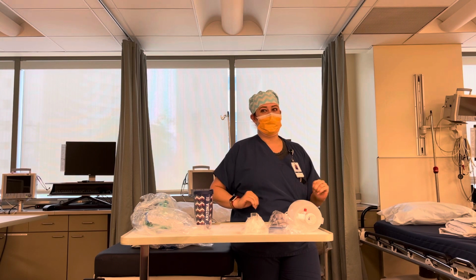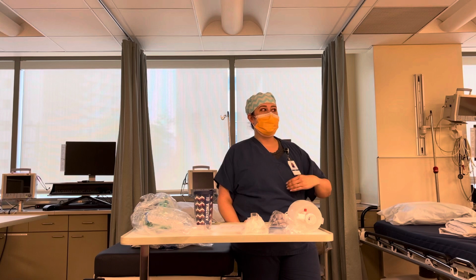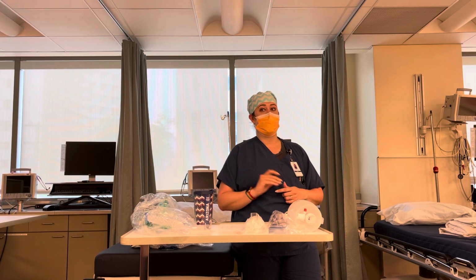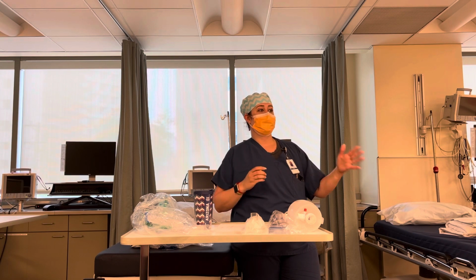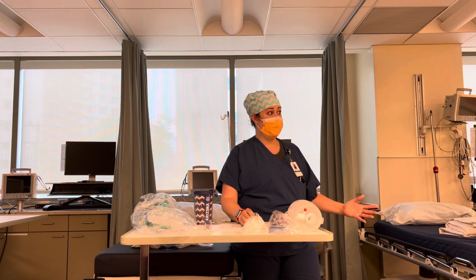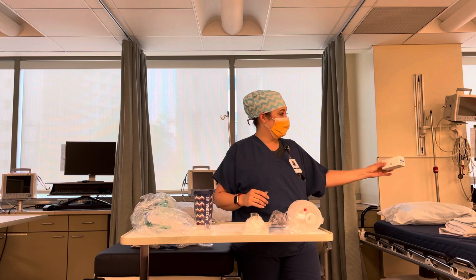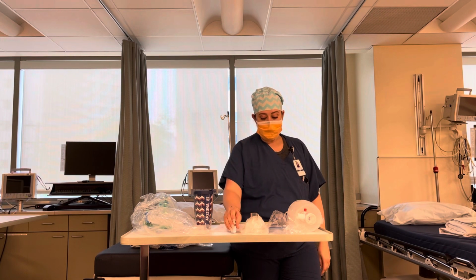I know the recommendation is for it to stay in the fridge. But if it was me having an airway emergency, I would hope that the CRNA just had it right there. So I'm going to start keeping it on my cart, and when you work with me, I'll show you where I've been having it, but not every CRNA is going to do that. That's why it's very important you know where it's at. We can pass this around. You guys can look at the box, get familiar with it.